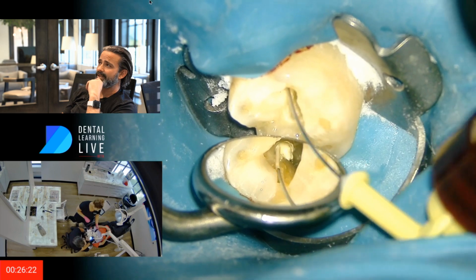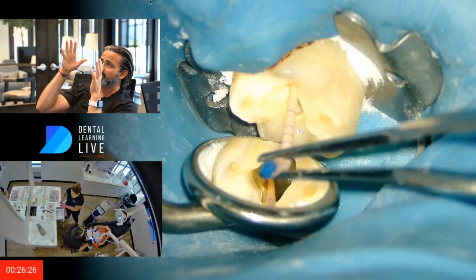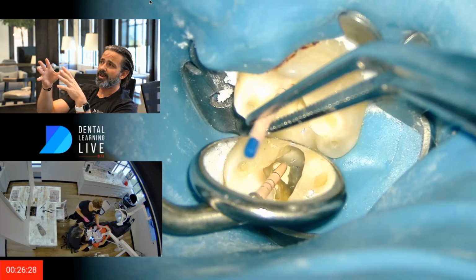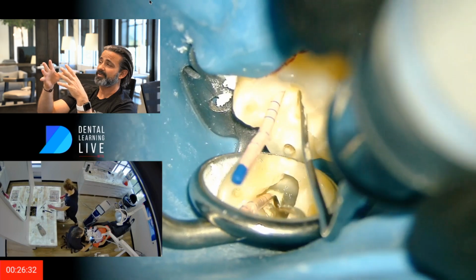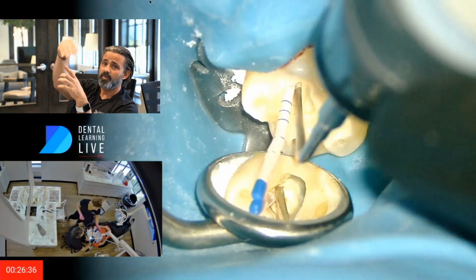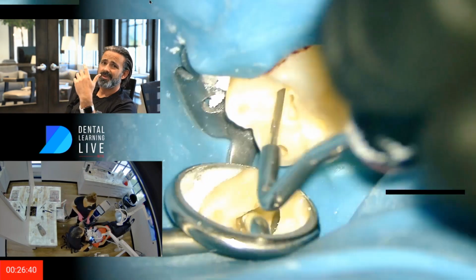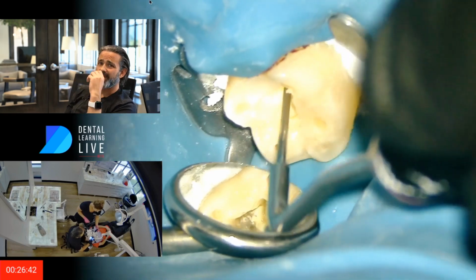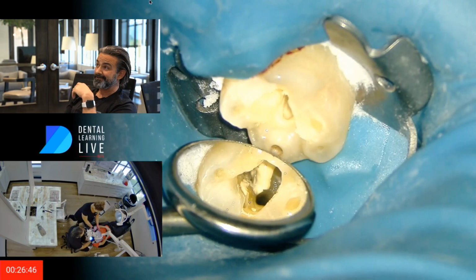Again, it's a habit, because when they go 2 to 1 like this in the mesial root, if I really obturate well and I pick up isthmus space, that lateral dimension, the Z plane, if you will, I know I'm going to push whatever small amounts of fluid from one canal into the other. So I always like to do things one at a time, and if anything's in there, I can wick it out of the other canal with another paper point or whatever I choose to do.